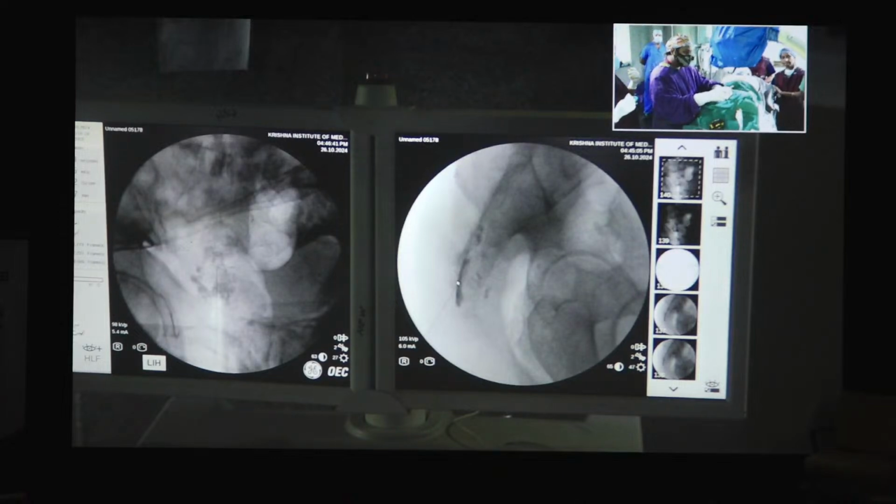So when you are doing a hybrid technique, when you have an old patient, it's always better to combine both ultrasound and fluoroscopy to do it very easily. Because if there are calcifications, it's very difficult to enter the canal. So always use ultrasound and fluoroscopy guidance to do the caudal epidural.